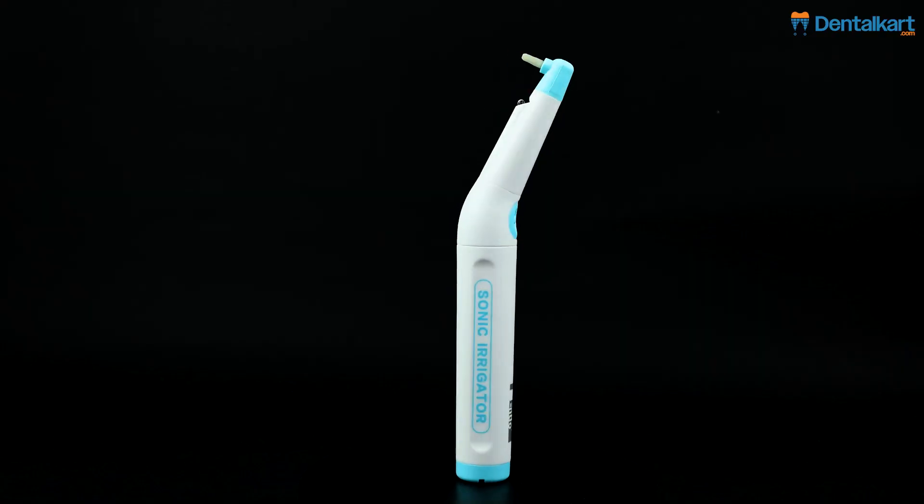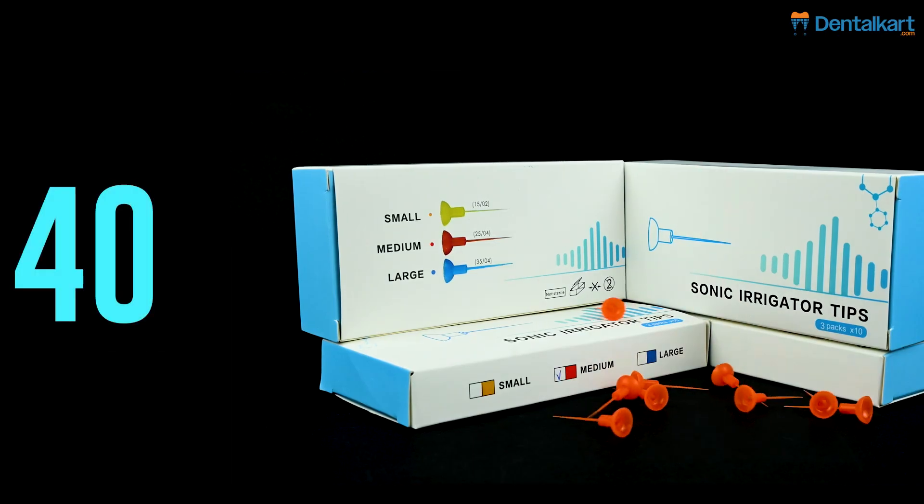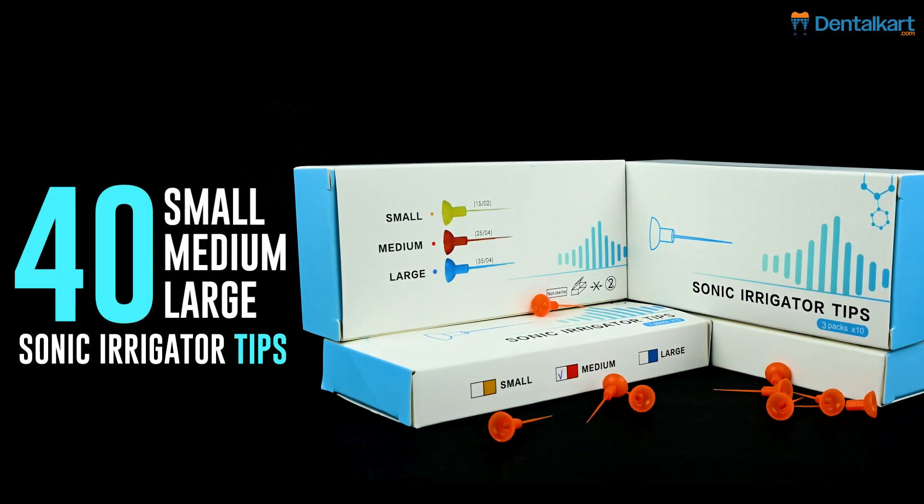Let's see what is inside the box: one sonic irrigator, 100 pieces of protective sleeves, and 40 pieces of small, medium, and large sonic irrigator tips.